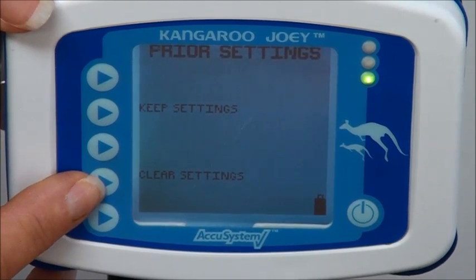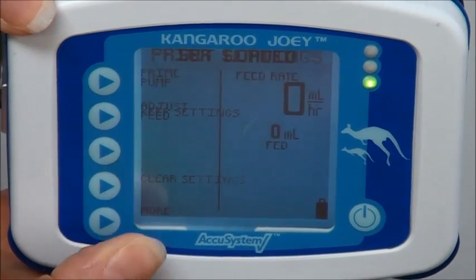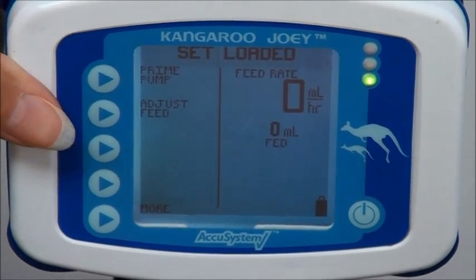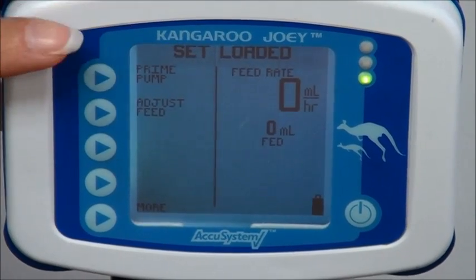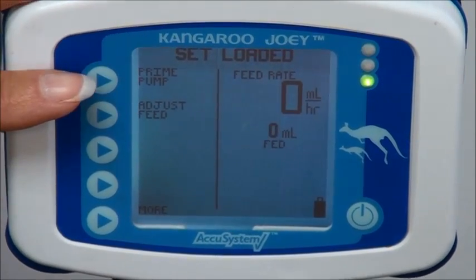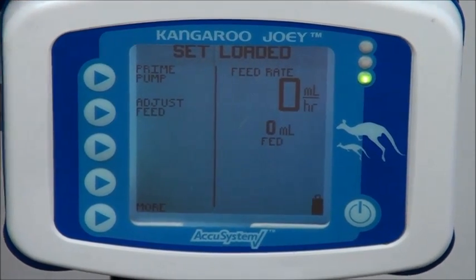So there's a button with an arrow right next to where it says clear settings. I'm going to push that button. And then a new screen is going to pop up and it's going to tell me that my set is loaded and it's going to give me two other options, to prime the pump and adjust the feed. We're going to do both of those things.